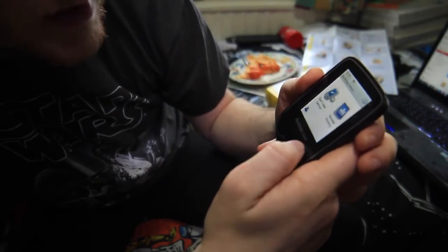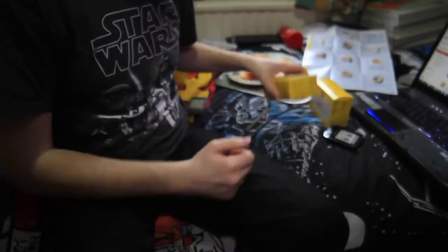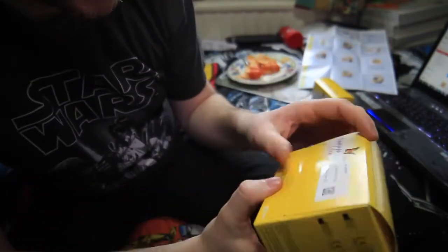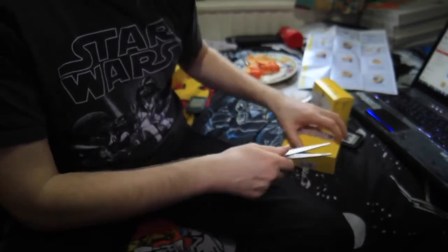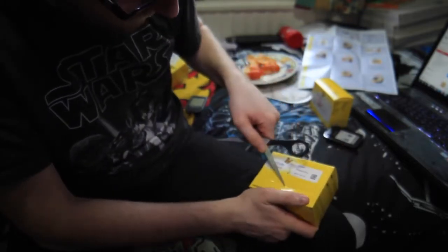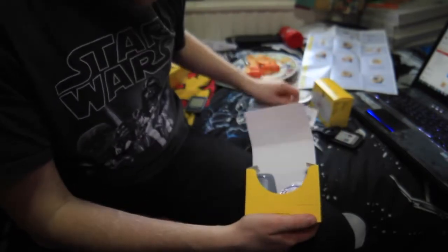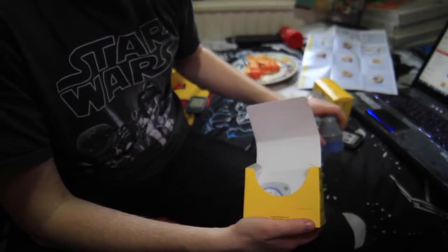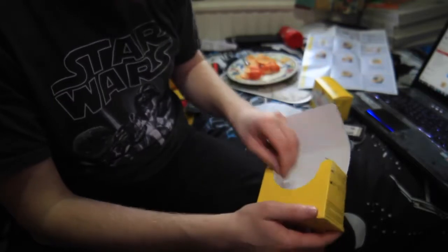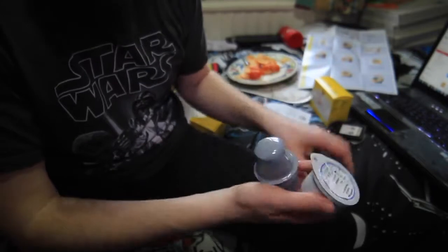It says no active sensor — that's pretty much it for setup so far. Putting that back, and in this box here we have the Freestyle sensor, so let's open it up. I've been getting a few more hypos since I started the potato/starch diet that Dr. McDougall recommends — not because there's anything bad with the diet, but because I'm becoming more insulin sensitive.